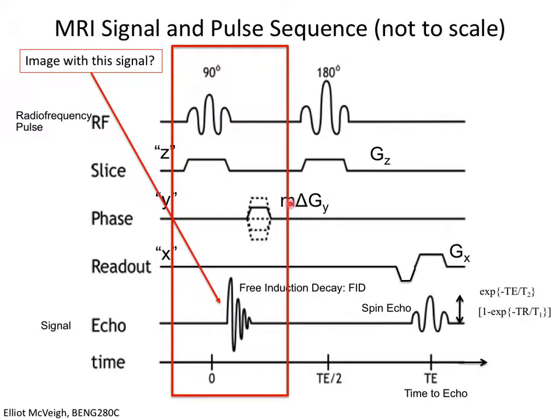And we have to move these gradients in time back closer to this RF pulse such that everything happens right after the RF pulse, and then we can measure our signal. Right? And that's called gradient echo imaging, because we're making the image from the free induction decay. We're going to cause an echo in this signal, but it's actually just a refocusing using gradients.